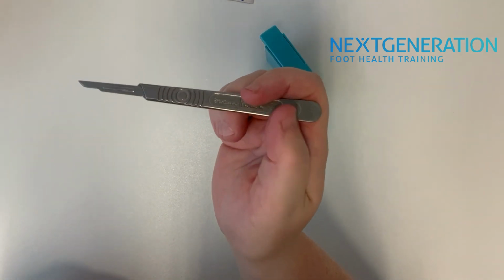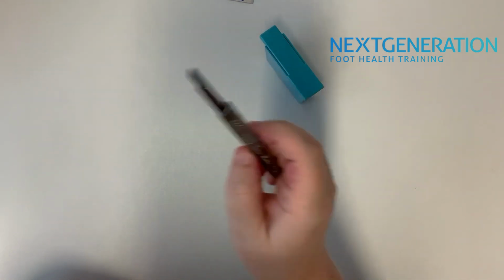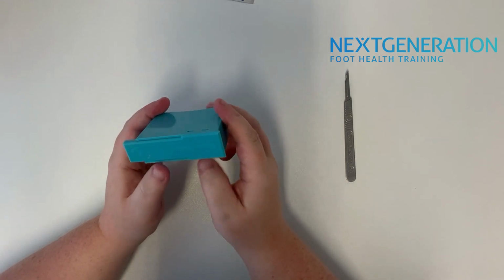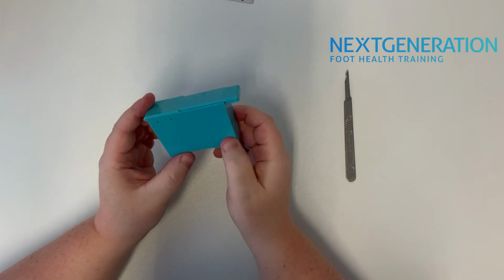So whilst we've got this on our handle piece, we need to be very careful because that is very sharp. So I'm just going to put that down for 1 second. Next thing I want to discuss with you is your actual blade box. So this is a Swann Morten blade box, again, makers of it.